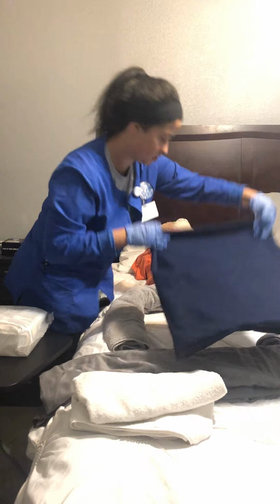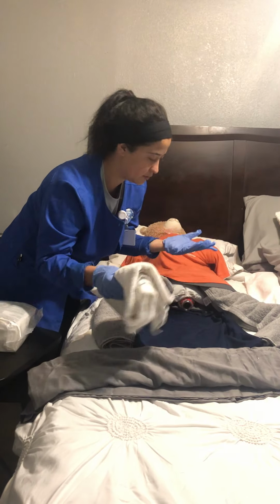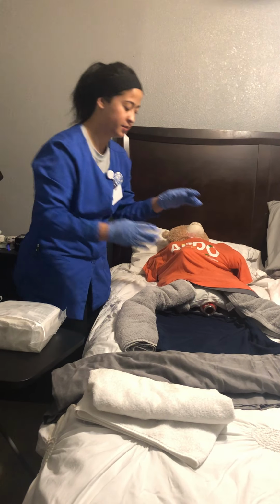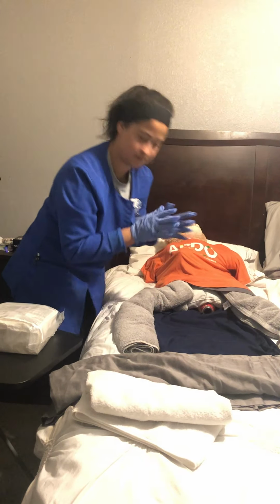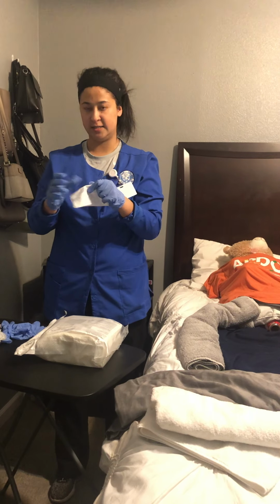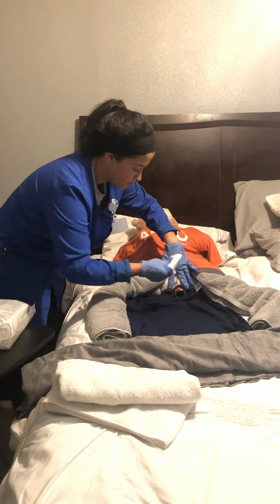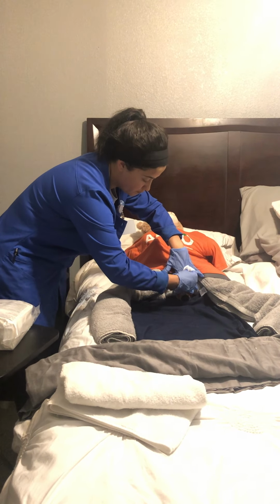I would just ask her to lift her thighs up. If she was older, I would prop her hips up just to help with the placement of the catheter. But we're not gonna prop her up today. She's young and vibing. So I'm just going to get a towel, wrap it around my hand. I am going to spread the labia. I'm going to wipe the furthest one away from me.